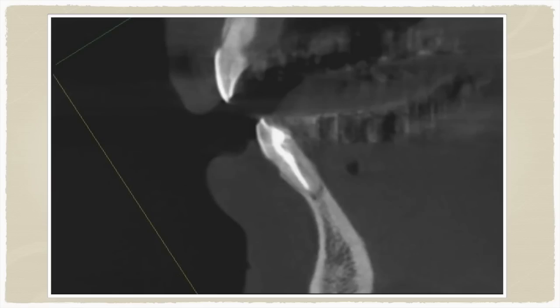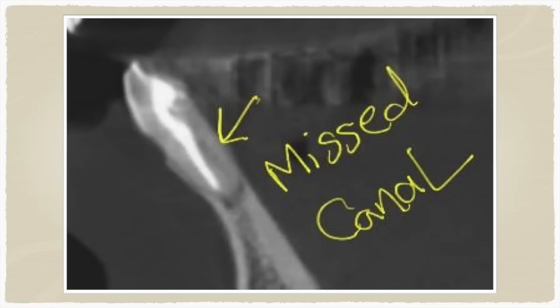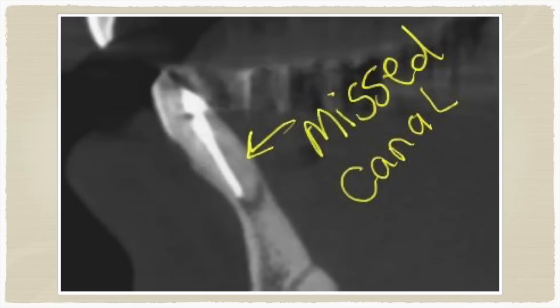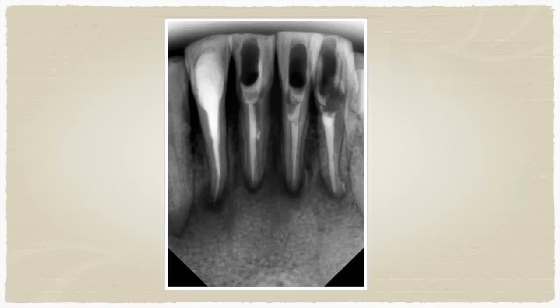A CBCT was taken to help make the diagnosis. CBCTs are very helpful in cases where you're trying to triage a retreatment or apical surgery. On a sagittal section, you can see that the root canal has been filled to the end and there is some periapical infection. But at higher magnification, you can see a missed lingual canal in the central incisor, and this is also present in the lateral incisor. These root canals appear filled on a straight facial periapical radiograph, but the CBCT sagittal section reveals this missed canal and diagnoses the source of the problem.